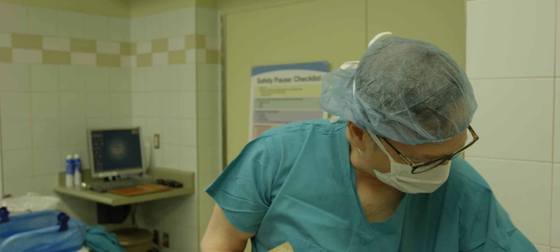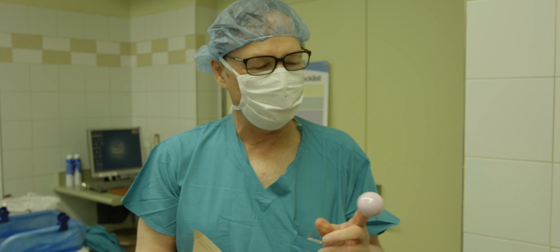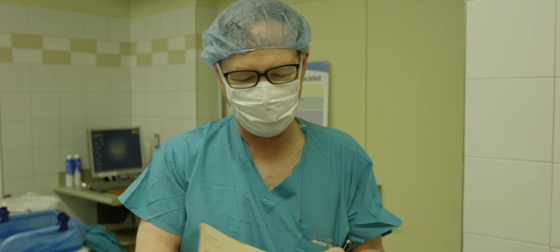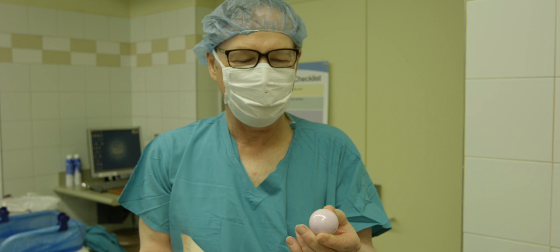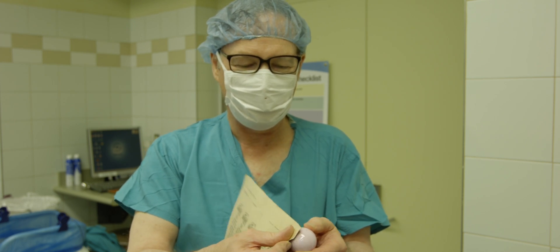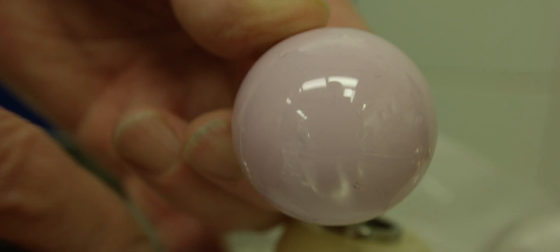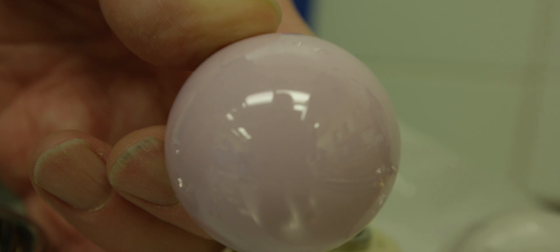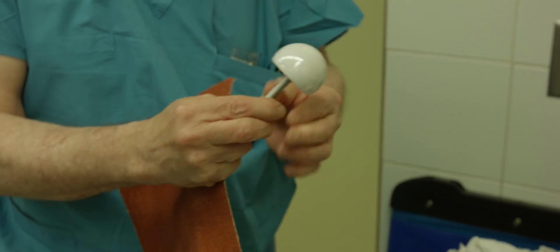Now moving on to a very commonly used Delta ceramic femoral head. It goes into use every day right here in hospitals — someone's getting one right now, I'm sure. I'll put a little sandpaper on it, going to a new edge of the sandpaper. Couldn't make a blemish on it.